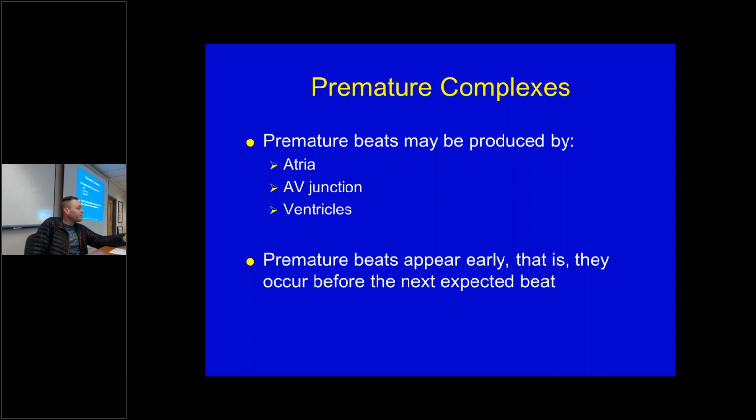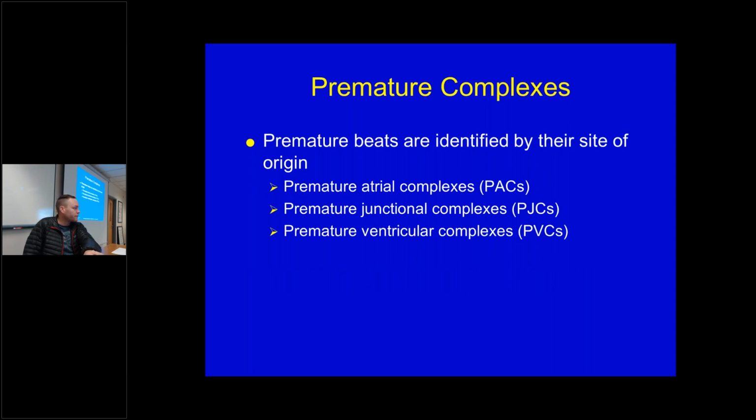What lead would we see this on a 12 lead? And are we going to have a detailed explanation of each one? Of each of the leads? Yeah. For the most part, when you're looking at atrial rhythms, you're looking at lead 2. Okay. All right, so lead 2 is where you're going to see P wave morphology. Because in other leads, even in normal sinus rhythm, you're going to see P waves that are inverted. You're going to see different things depending on where they're at. When we're talking about these normal complexes and where you're recognizing changes in morphology, you're looking at lead 2. All right? And no, you don't have to memorize all the different changes in morphology in all of the leads. That would be ridiculous, and I think redundant. I think that's wasted information.